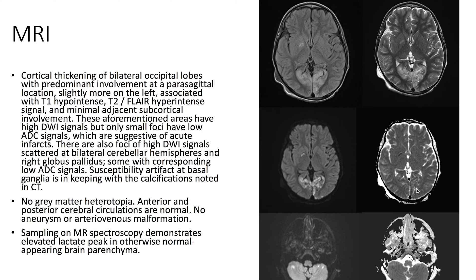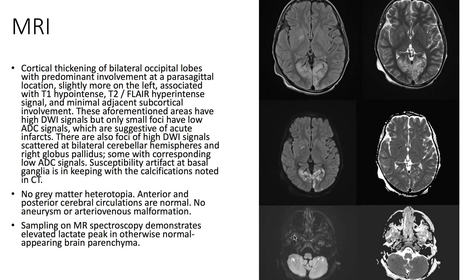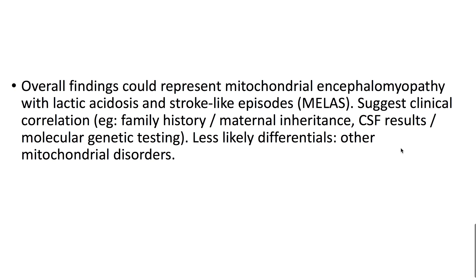There are also foci of high DWI signal scattered at the bilateral cerebellar hemispheres and right globus pallidus, some with corresponding low ADC signals. Overall, the findings could represent mitochondrial encephalomyopathy with lactic acidosis and stroke-like episodes. Thank you.